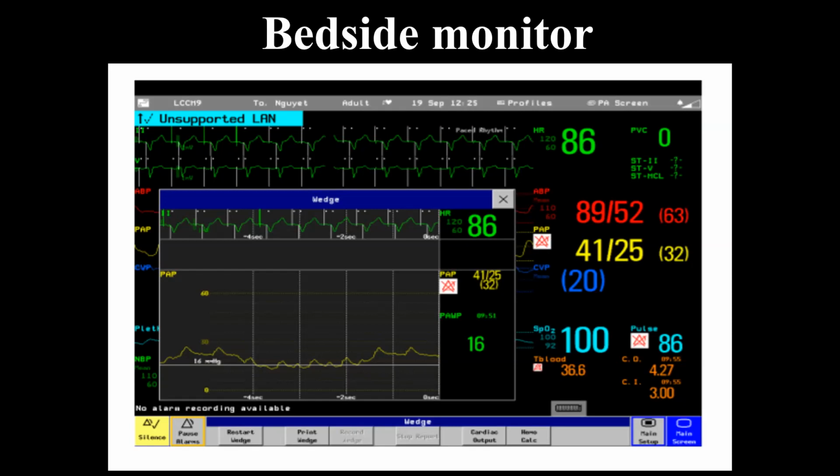The wedge is, it's low, right? Because it should be, nope, 18 to, nope. It's high. So now we've got left-sided increased preload. We've got right-sided increased preload, don't we? We've got a volume issue here, don't we? And we have pressure within here, but what the hell is going on with this blood pressure?